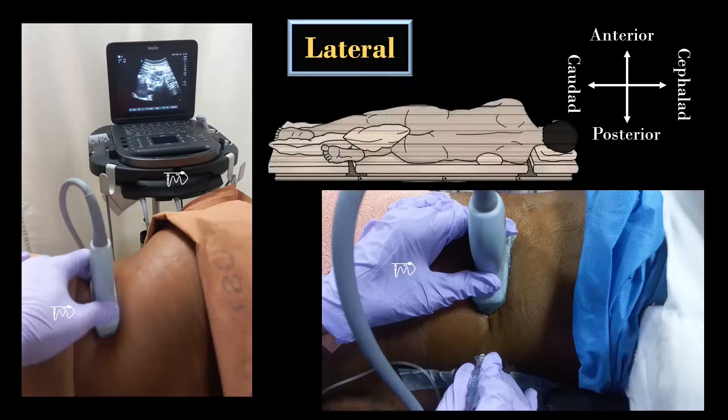The patient is placed in lateral position with the side to be blocked turned upwards, as demonstrated in previous QL videos. The performer stands behind or in front of the patient. The transducer is placed in the transverse orientation over the abdominal flank at mid or posterior axillary line, immediately cranial to the iliac crest. The needle is inserted in-plane from posterior to anterior, anterior to posterior, or using an out-of-plane technique.